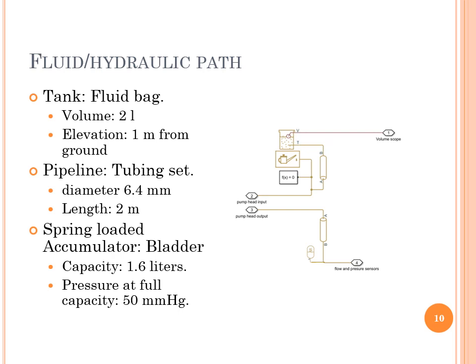The tank serves as the fluid bag. It is kept at a constant height to provide a basic flow due to gravity pull. The pipeline serves as the tubing set that feeds the fluid from the bag to the pump and then to the operation site. The spring-loaded accumulator serves as the actual bladder. It has a maximum capacity same as the bladder and provides a pressure that is proportional to the volume.